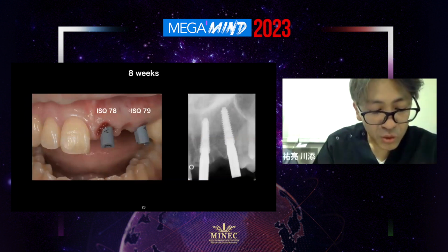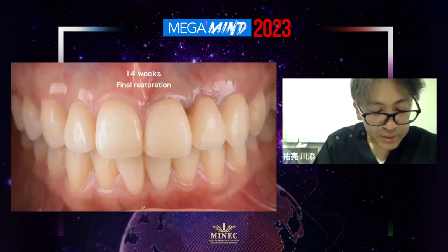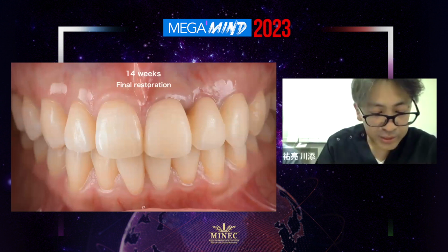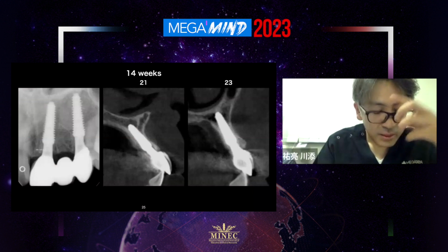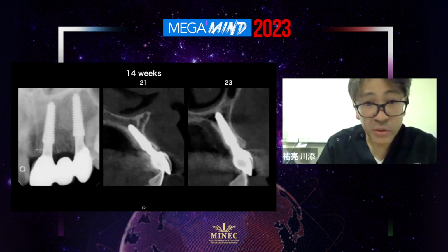The ISQ was stable, so I took an impression using Prime Scan. The implant superstructure was placed 14 weeks post-operatively. It can be seen that there is no marginal bone loss and progress is good.